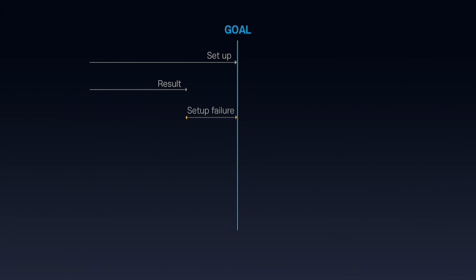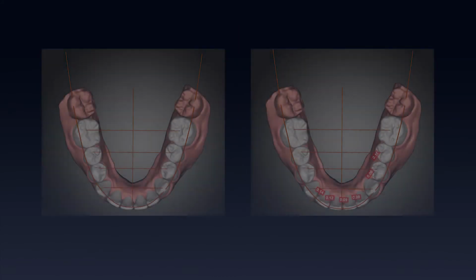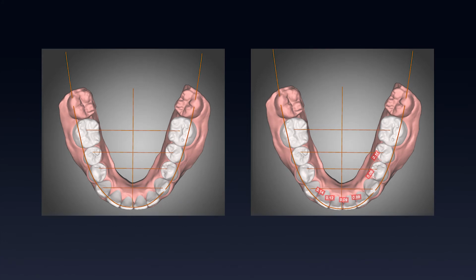If you apply overcorrection, compared to setting up only as much as the target value, you can increase the setup success rate. I will explain the case of using overcorrection. In the case of the spacing case, better results were obtained by giving overlapping values to the teeth.